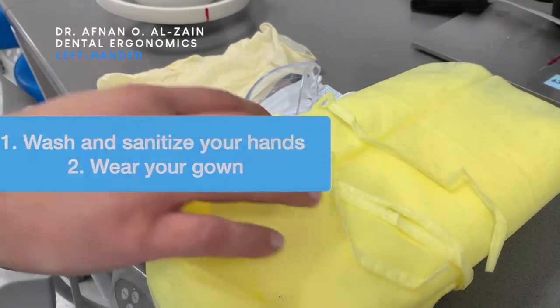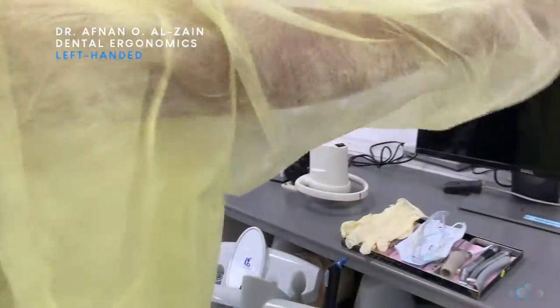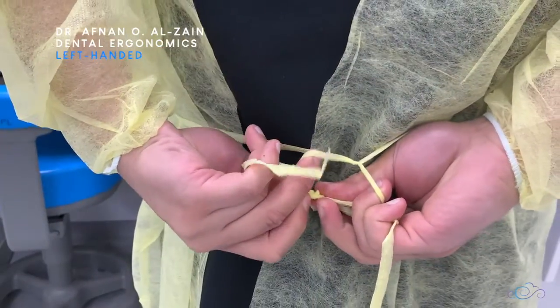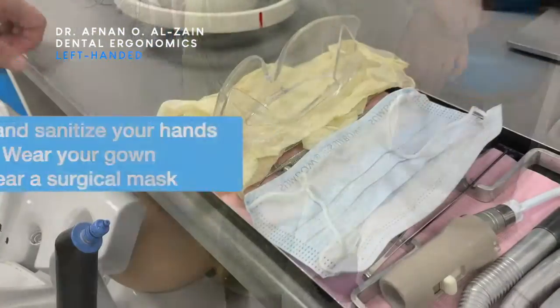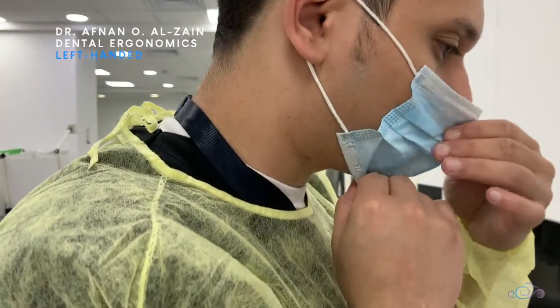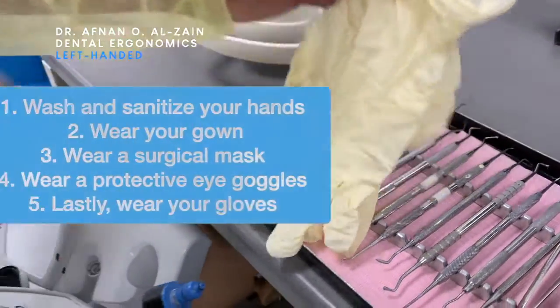Then you will wear your PPE starting with your gown, then you will wear the surgical mask, then you will wear the protective eye goggles or face shield, and last but not least you are going to wear your gloves.